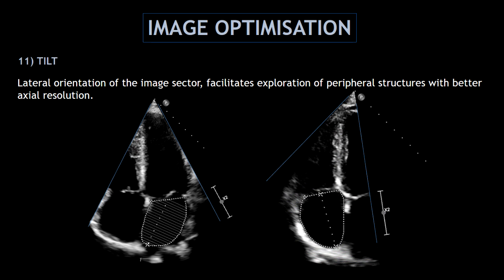Our next feature is the tilt, and this is the lateral orientation of the image sector. This facilitates the exploration of peripheral structures with better axial resolution. Here I'm showing how I adjust the tilt during the scan — on the left side, I'm tilting the image towards the left atrium, and on the right side, I'm tilting the image towards the right atrium. This allows me to concentrate on those structures, obtaining a better axial resolution.